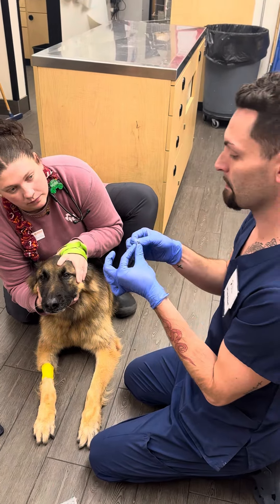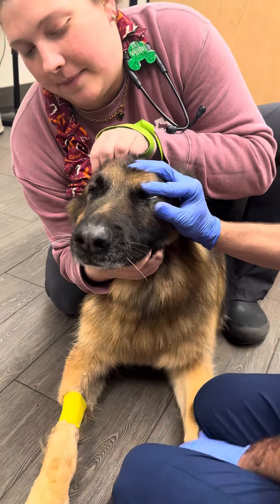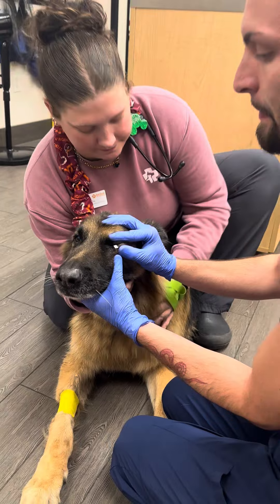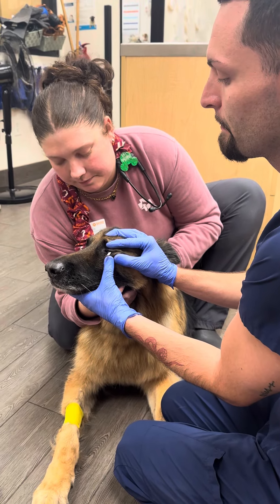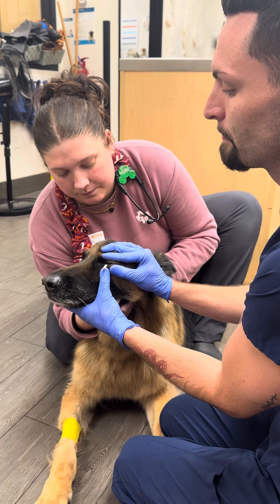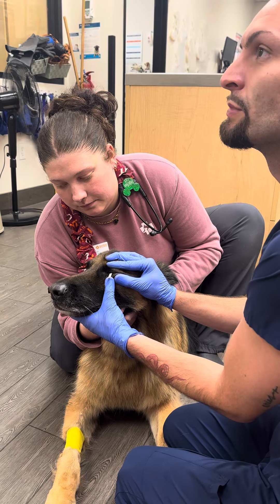So what I'll do first is open, fold this part, and then I will lower the eyelid, get close, place in here, and just close his eye.